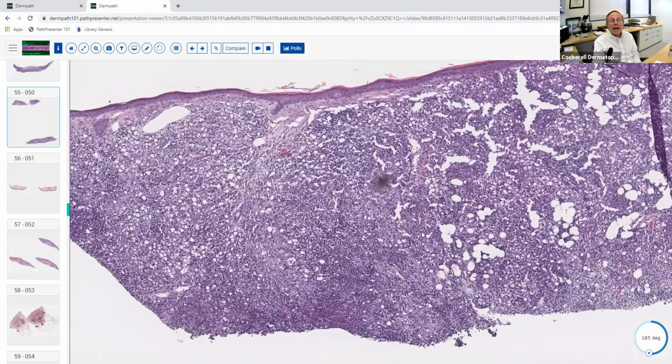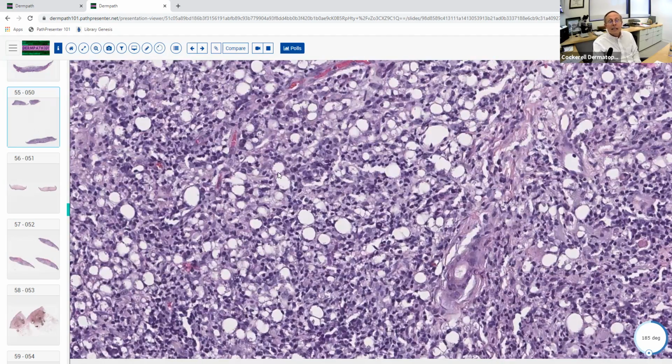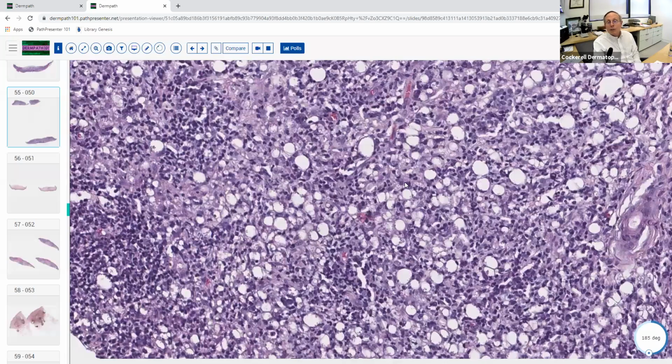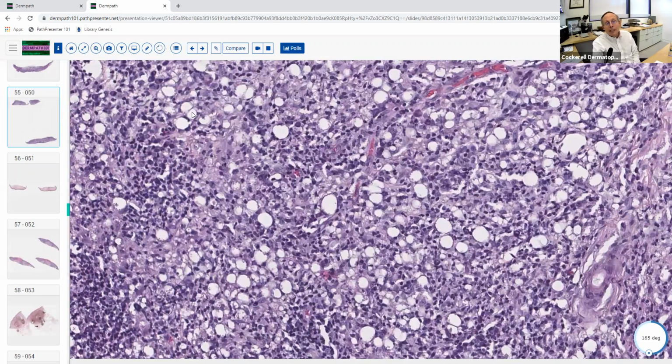At higher magnification, we begin to see that these little holes are histiocytes, and they contain something in the cytoplasm. They contain these little tiny dots at the rim of these histiocytes. So these are histiocytes primarily with lymphocytes and some plasma cells in it. And when you see that pattern, bubbles plus intracytoplasmic organisms, the best diagnosis in this situation is leishmaniasis. Leishmaniasis.